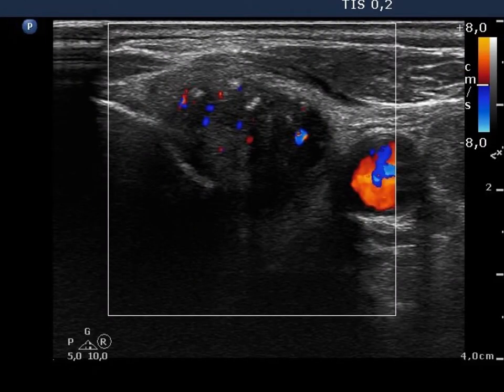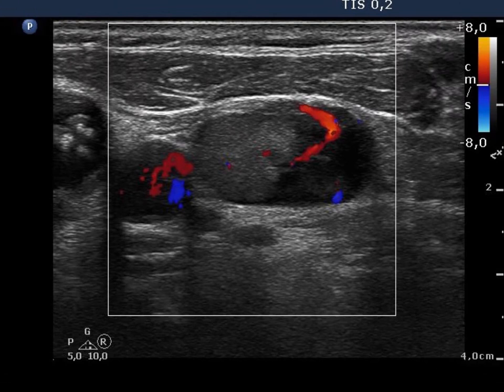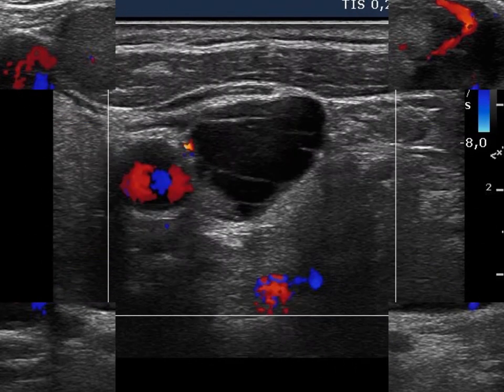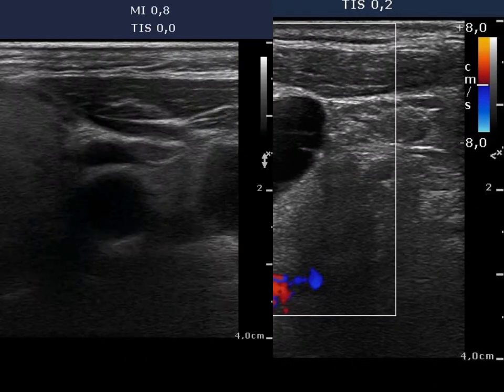The thyroid nodule and one lymph node present an intralesional vascular pattern, while another node displays no vascularization.